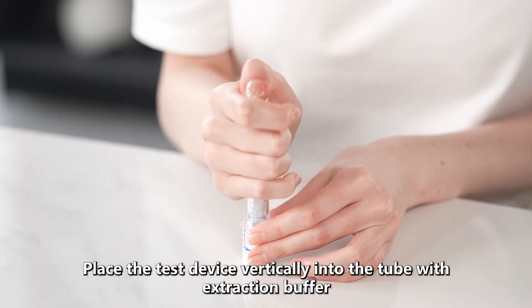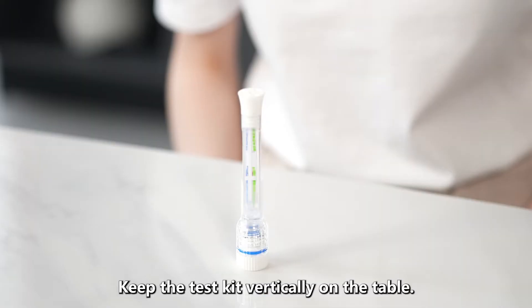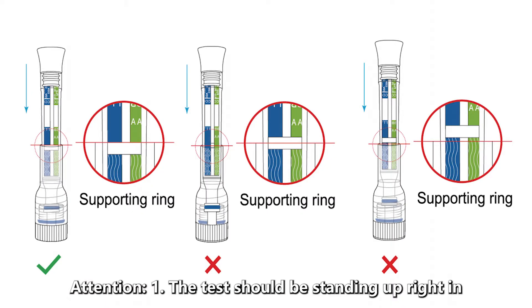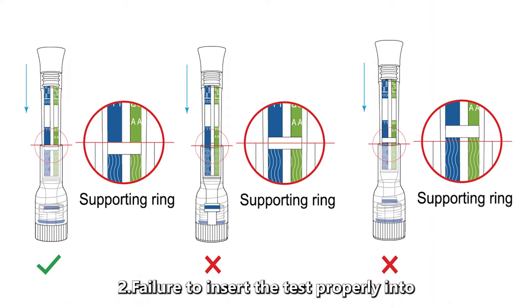Place the test device vertically into the tube with extraction buffer until the top edge of the tube reaches the top of the supporting ring. Keep the test kit vertically on the table. Attention: 1. The test should be standing upright in the tube with extraction buffer. 2. Failure to insert the test properly into the tube can lead to incorrect results.